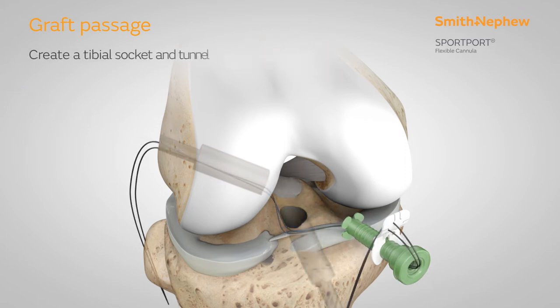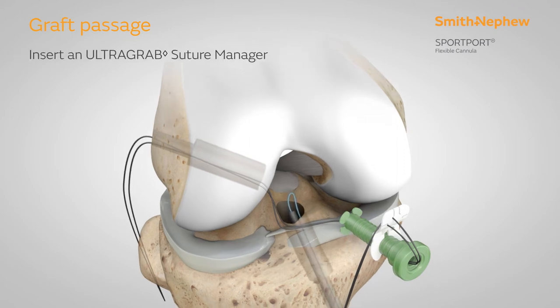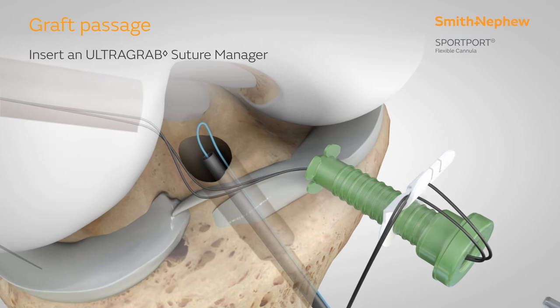Repeat the TrueNav steps to create a tibial socket and tunnel. An ultra-grab suture manager can then be passed on the tibial side.